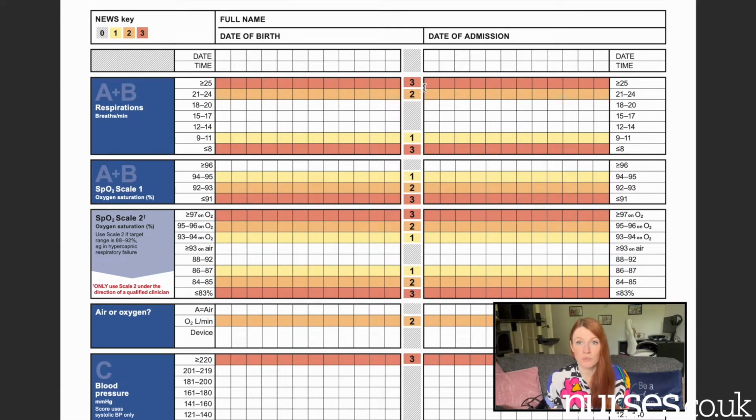As you can see, within the chart, you've got these different colours. So red is 3, that is warning. 3 for warning. If it's red, it's not good. 2 is amber, sort of orangey colour. 2 is still a warning, it's still not good, but it's not as bad as a 3. White is normal range. We're happy in the white zone. Everything's okay, hopefully. And then this yellow one is like, something's going on, I'm not sure what. We're going to give it a 1.